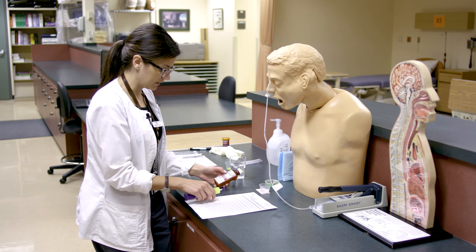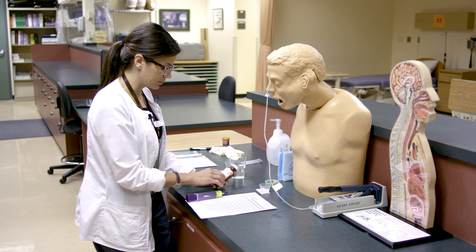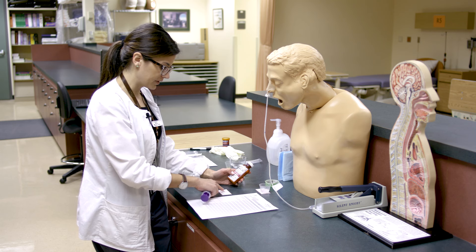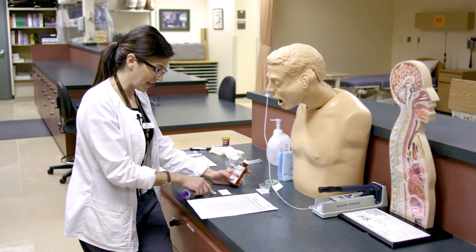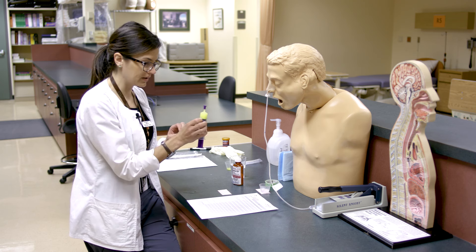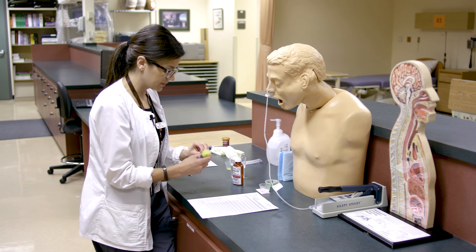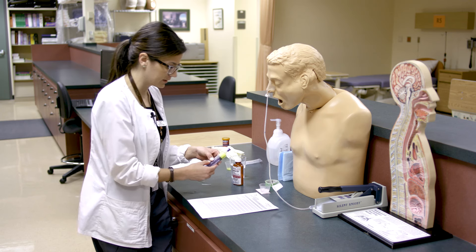For the Dilantin second check: right drug — Dilantin 125, suspension. The dose is 250 milligrams, which is 10 mLs since it's 125 per 5. The route is nasogastric. We confirm with the syringe that we do have 10 mLs with no obvious air bubbles displacing the measurement. He gets it daily, and now is the time it's due. We can attach the label to the syringe somewhere that doesn't occlude the markings.